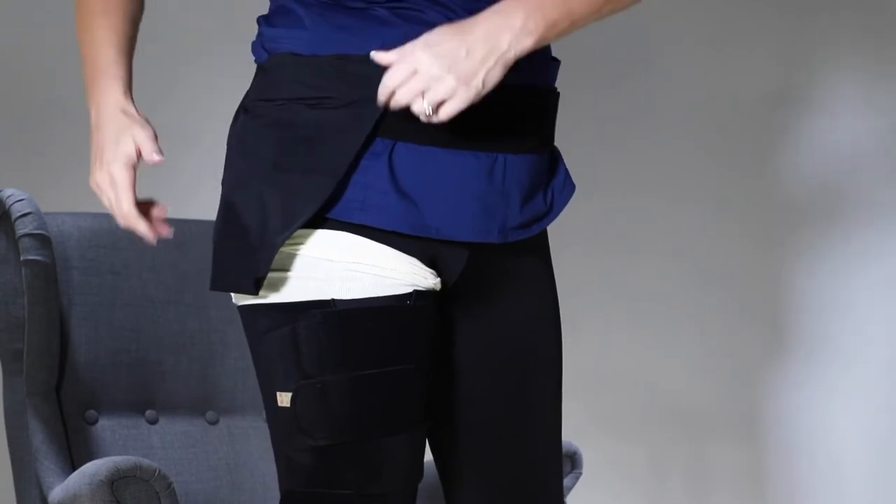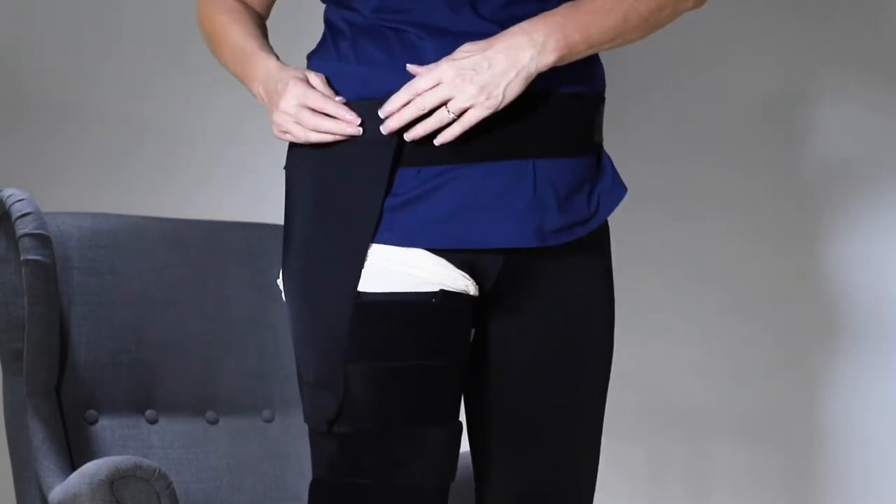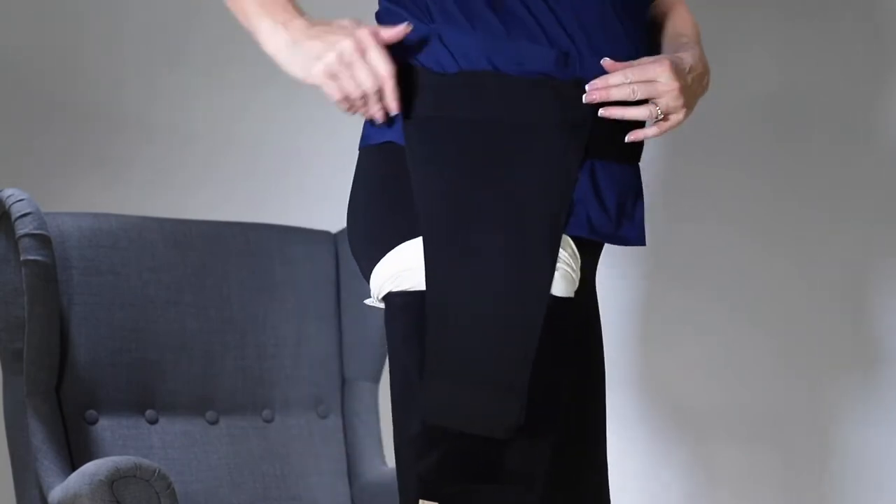Stretch the hip panel down slightly and attach to the thigh garment. Take care.